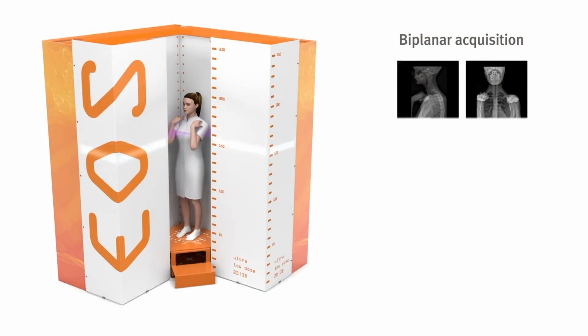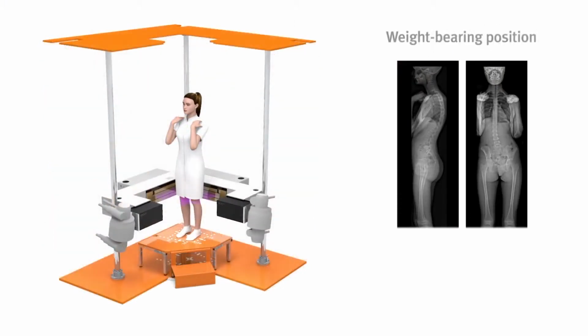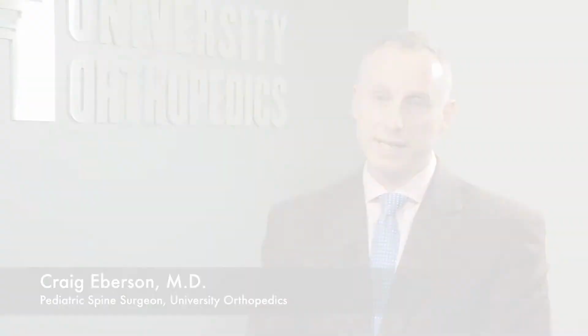Don't be shocked initially by the sticker price. Clearly, it's expensive technology relative to a simple plain x-ray, but it's better than a simple plain x-ray. And the improvement in your practice in terms of efficiency, of safety to your patients in terms of radiation, the ability to truly monitor what you think you're doing and make sure you're actually doing it post-operatively with x-rays really is going to make your practice better, it's going to be better for patients, and ultimately the price that you pay for the machine is a small fraction of the value you're obtaining.